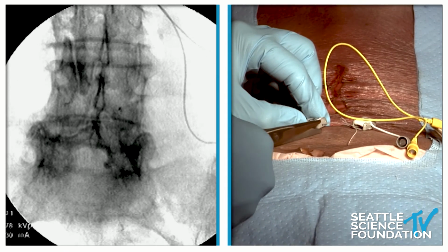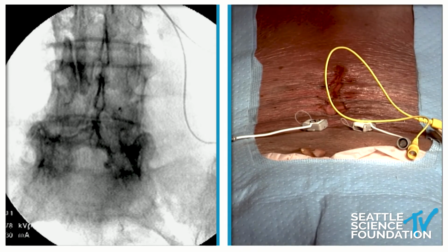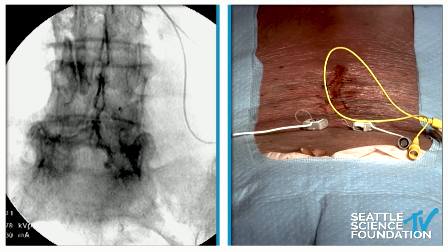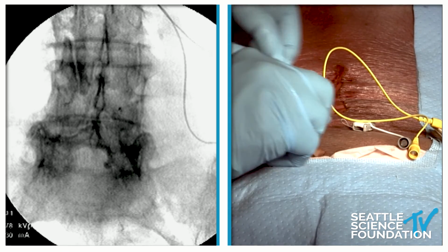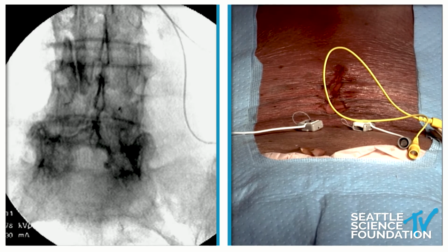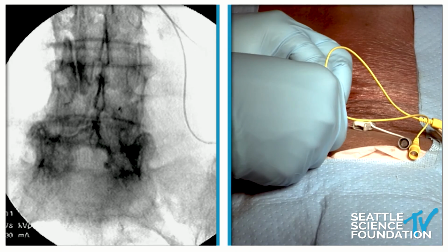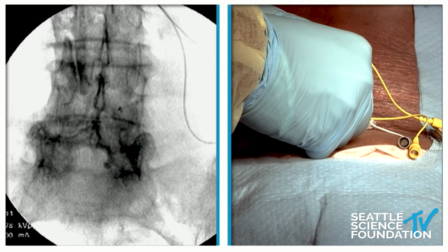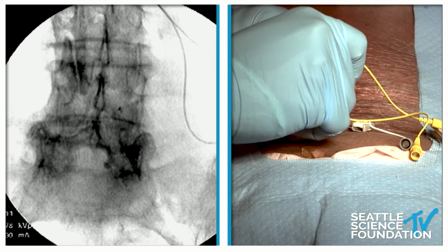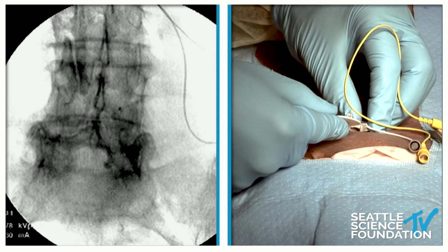So basically, this lead coming off the back is unnecessary. I give it to the patients so they can look at it, see what's actually in their body, and they're always like, oh, that's really cool, it's really tiny. So there's the back. Then we take some Dermabond, and we basically drop a drop of Dermabond on each one of these insertion sites, and then we take a circle little cassette, which basically slides in like so. And that's beautiful. We'll take another circle cassette. Beautiful.